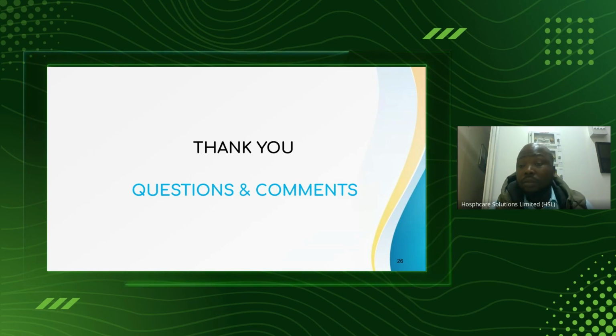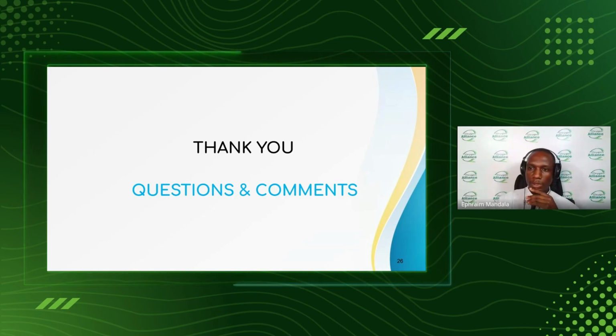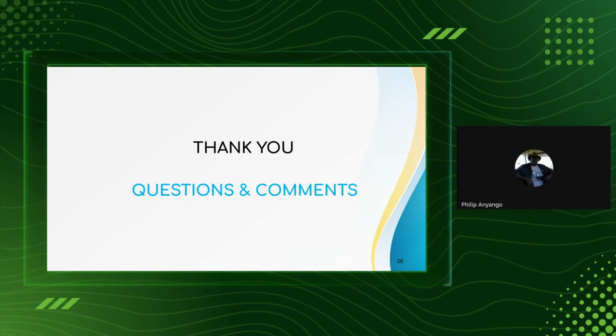Thank you. All right, so I saw a hand from Philip, so you can unmute yourself and speak. Mine is just a comment. Number one, an intermittent problem, particularly the intermittent movement of the head, where sometimes it's there, sometimes not there, could be as a result of a dry joint. The fact that it's there sometimes means that the components are working. So first of all, the first culprit is the dry joint, or you look at the contact of the switches. They might not be making properly.